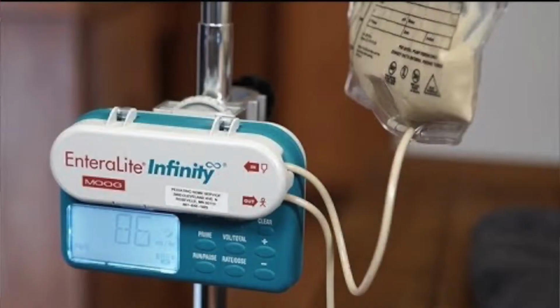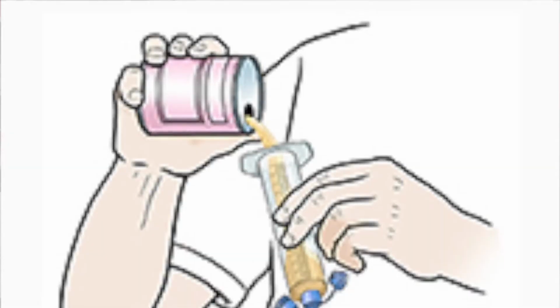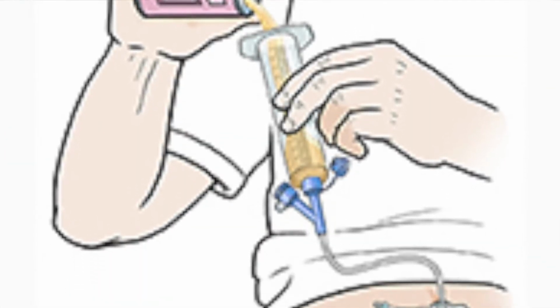So you can either be pump fed, which is the case with most jejunal feeding because you can't have a lot of liquid going into jejunal at once, it needs to go slowly. But with gastrostomy feeding or feeding into the stomach, actually you have something called bolus feeding, which is feeding that you do maybe every 3-4 hours, and you give a couple hundred mils each 3-4 hours, so it's more like eating a meal. And this is fine for people without stomach motility issues. If you have a slow moving stomach, like me, you can't do that. That's all there really is to know about feeding tubes.